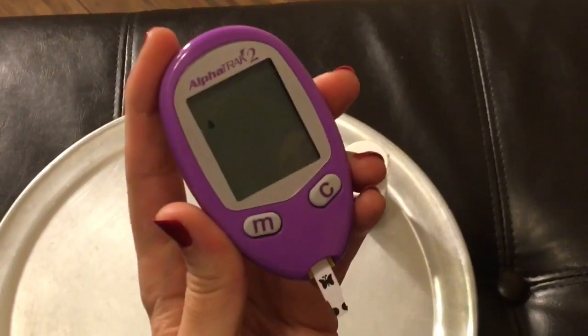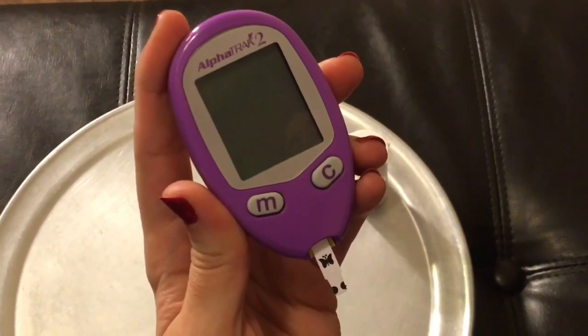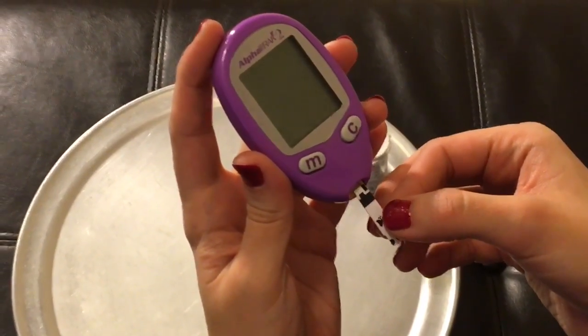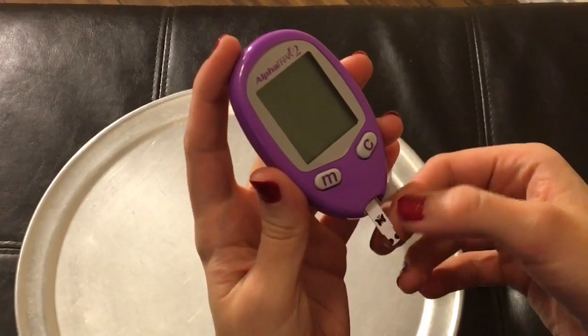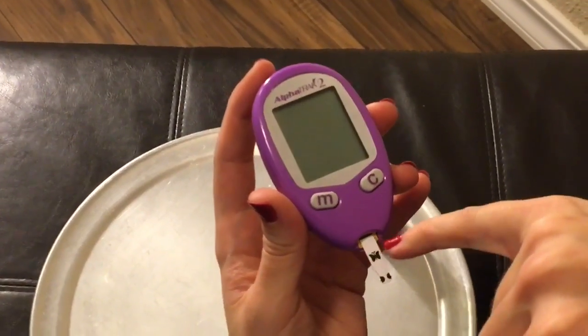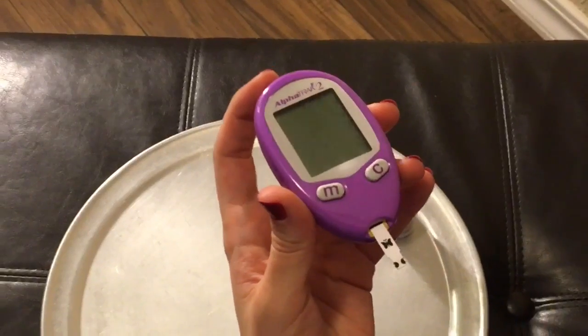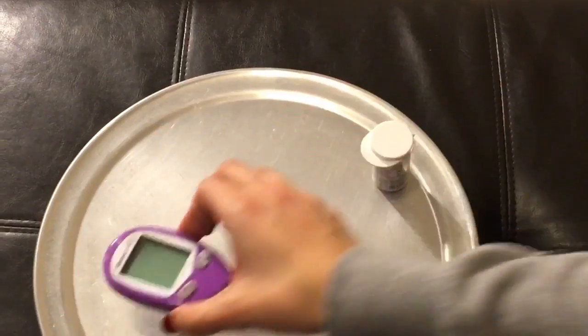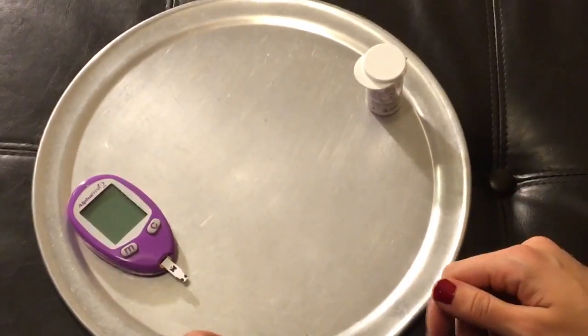Once you make sure your number is set, you should see a little blood drop and test strip dancing around on the screen. That means you have about two minutes to take blood. So what me and Penny do is we take the test strip out and put it back in partially — not all the way. Notice how the test strip is hanging out a little bit — it's ready to go and the meter is off. This saves our two minutes for after we see her blood drop.